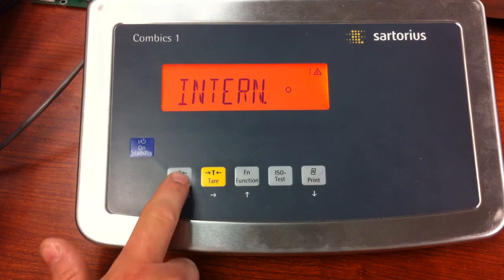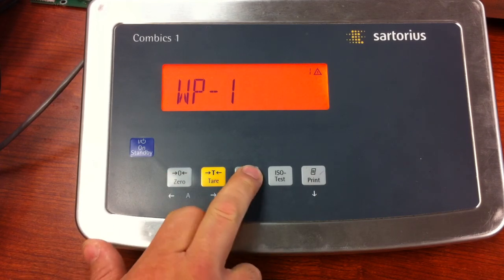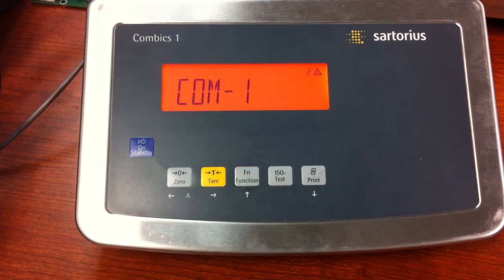You will still need to put a password in if you're making changes to the A and D converter, but that would be the only time you would need to use the service password. That password is 20-21-22, and that is the regular service password.